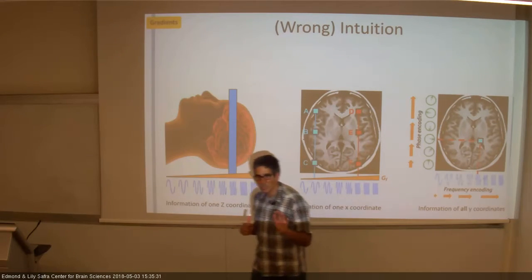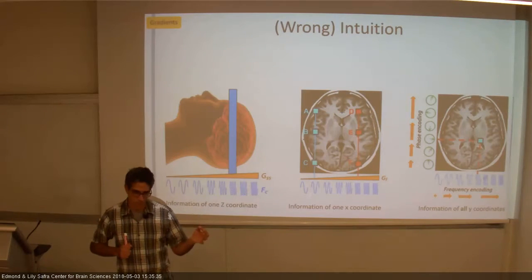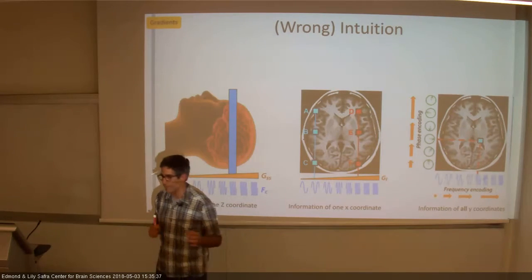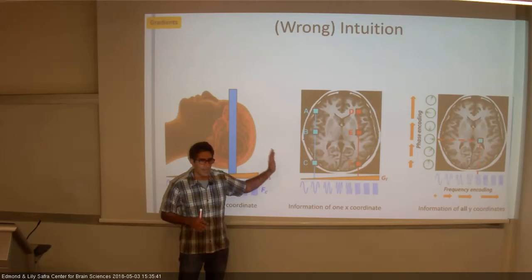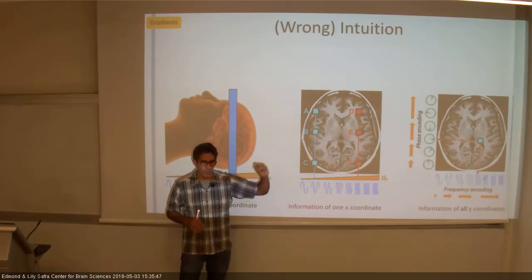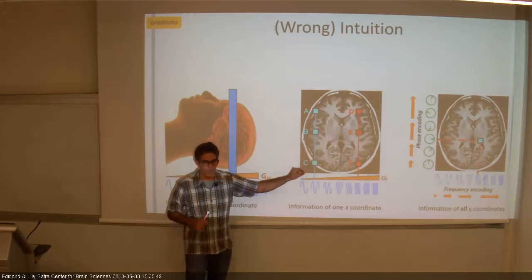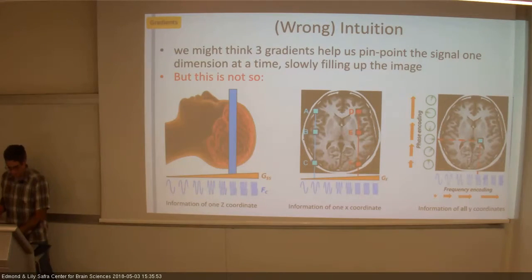We're not going to measure x, y, z in that sense. We're going to measure in k-space. So let's see how that goes. Okay. The information is here. You might notice that I have enough information to decode x, y, and z. But I'm not going to measure it point by point. Okay, that's going to take very long. Let's do something else.